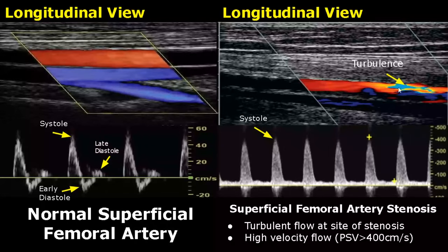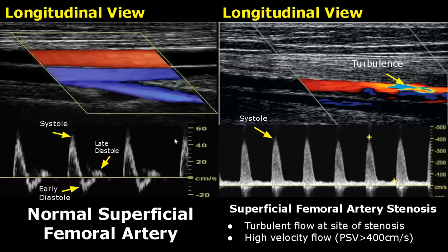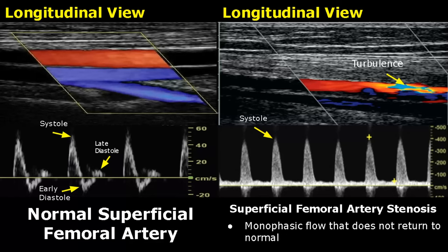In this case, we see severe stenosis of the superficial femoral artery. Turbulent flow is noted at the site of stenosis. We can see mixing of colors here. The PSV is very high — it has crossed 400 centimeters per second, much higher than the normal PSV of approximately 60 centimeters per second. This indicates severe stenosis. A monophasic waveform is seen here; we only see a systolic peak.